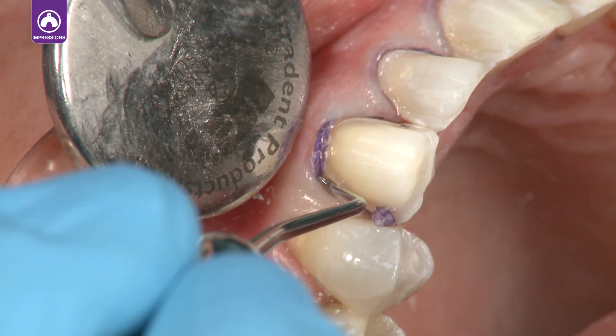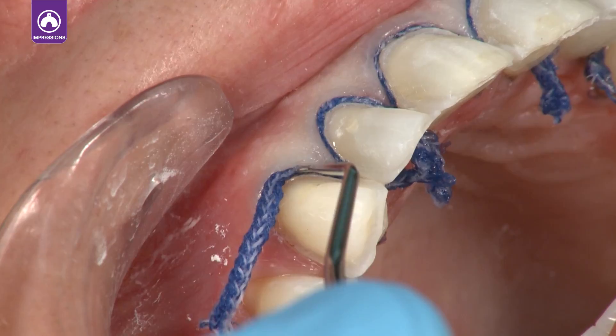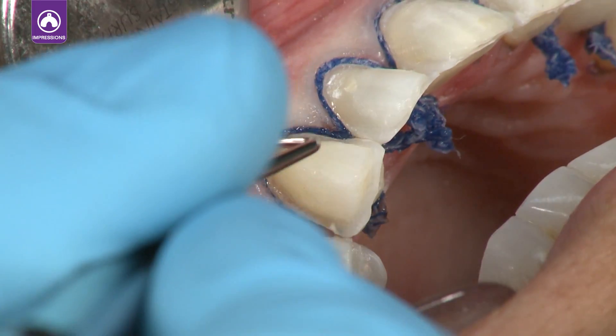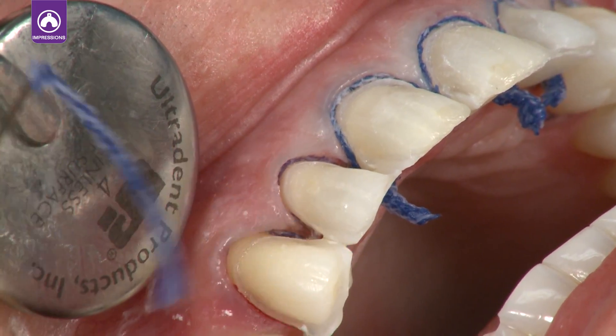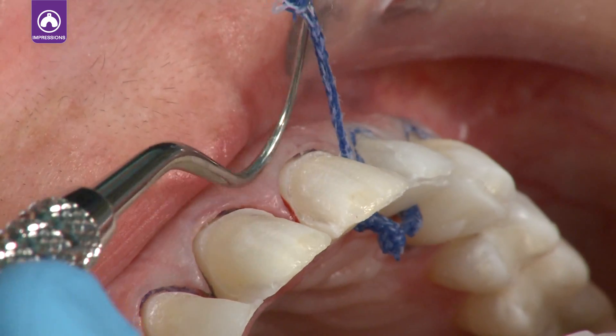Use Ultrapack knitted cord soaked in Viscostat or Viscostat Clear to obtain profound hemostasis. Using the double cord technique allows the Viscostat to penetrate deep into the sulcus. After hemostasis is achieved, remove the larger cord prior to making the impression.